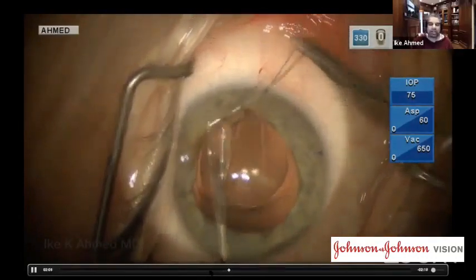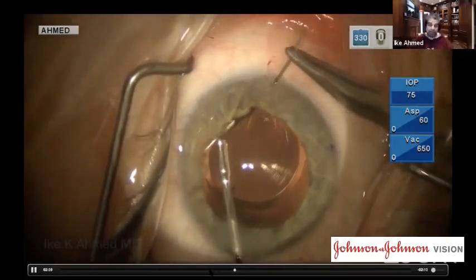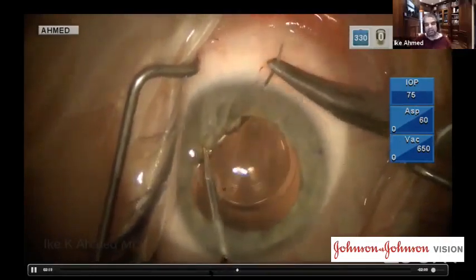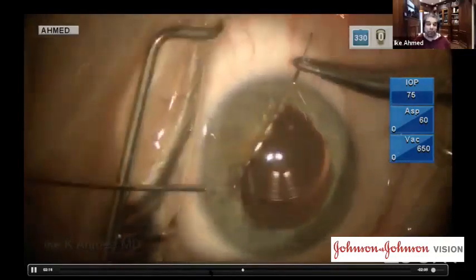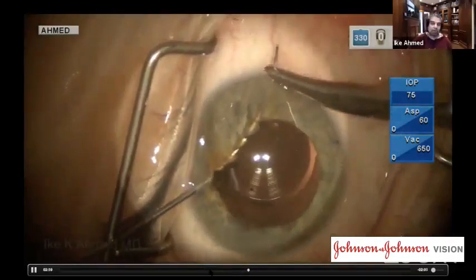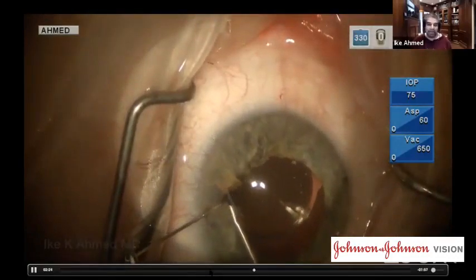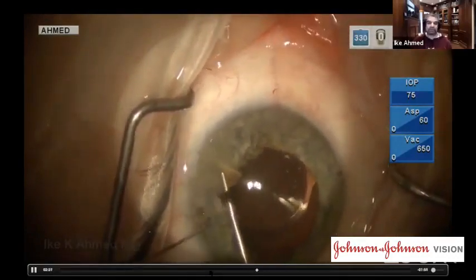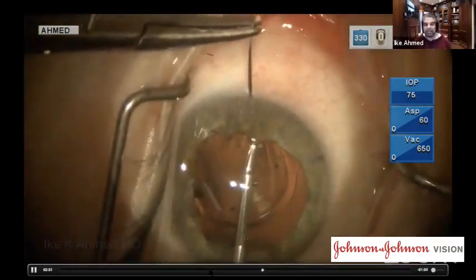What I want to note here is I've made four incisions to do the cerclage: the main incision and three other incisions. I'd like to note that the forceps here are being used to do the work. The needle is held in the anterior chamber, moves forward slightly, while the forceps is actually bringing the iris to the needle tip. Then it emerges from the eye very carefully, using a docking approach with a cannula to avoid entrapment of the needle in the cornea.